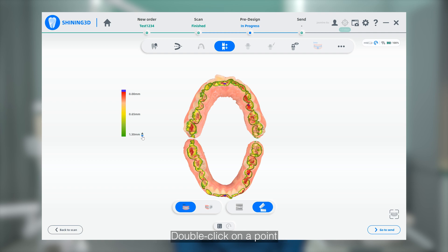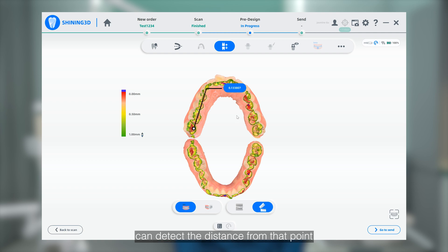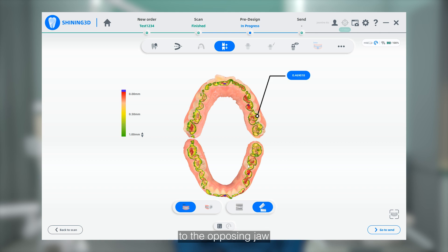Double-clicking on a point in the color bar displayed on the model can detect the distance from that point to the opposite jaw.